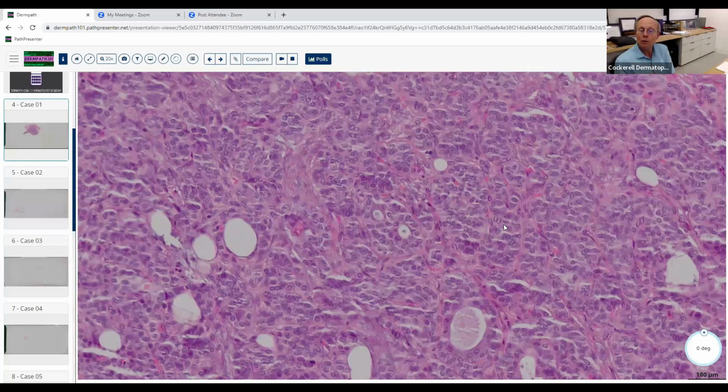And which sweat gland would you choose over the other? Would you choose apocrine or eccrine more likely? I thought I saw areas here that reminded me of apocrine. Okay, it was a good crack at it, but actually, if you think of the bottom of a sweat gland, the coil, the cells are undergoing a pretty high rate of metabolism.